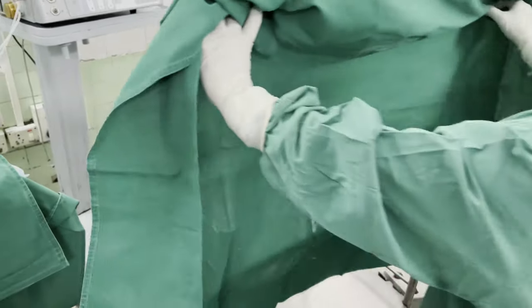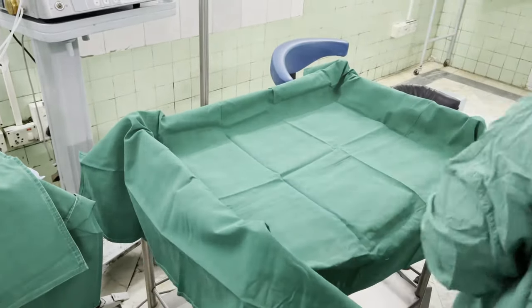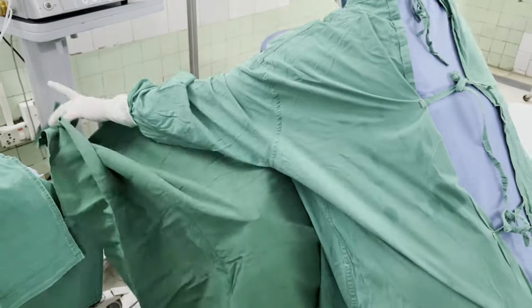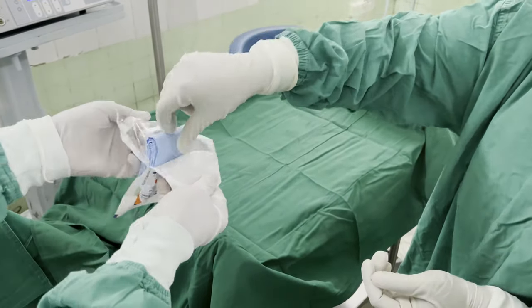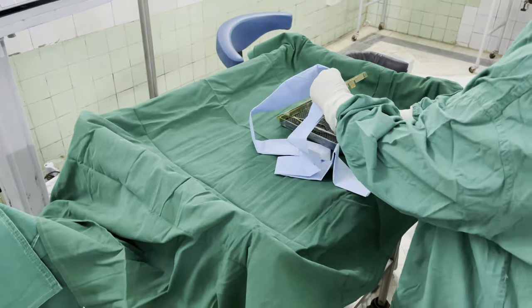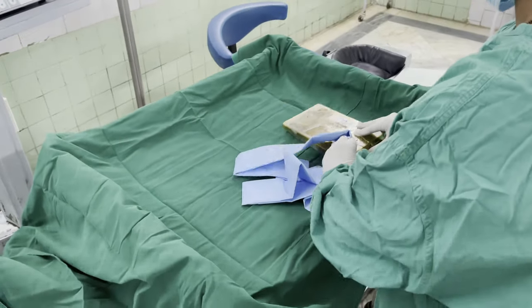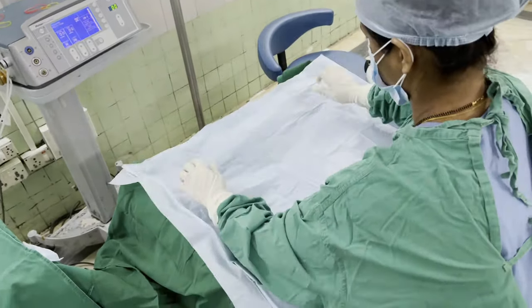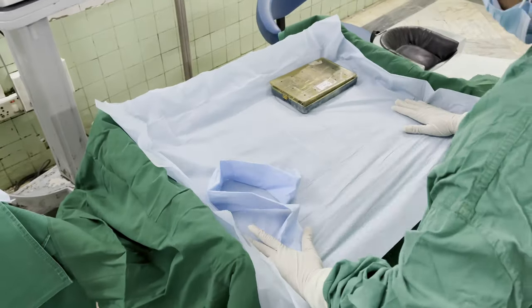Now, the setup of the trolley. At the outset, a sterile sheet is placed over the trolley. A second sheet is placed over it as well. And now the assembly of the trolley. A plastic sheet is then placed to prevent any soilage from any liquid leakage.